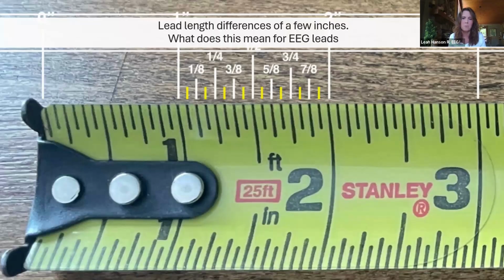And I'm just going to give you a very simple example. If you've got a 3T, so that T is the strength, you've got a 3T MRI system in your facility today. That's what your facility uses. Next week, they announce that, guess what? They bought a 9T. So they turn to you and they say, hey, the product that you're applying to that ICU patient for the MR cleared product, are those cleared for a 9T?